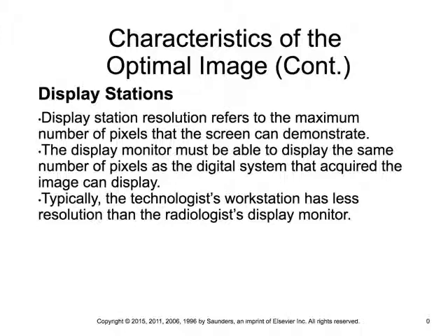So a lot of times what we do is we turn down the lights, we try to decrease the amount of light pollution or light noise in the area so that we can better visualize what we're looking at, right? But ideally they would just buy us nice monitors and nice ergonomic places to look at these pictures, so that we're not uncomfortable, sitting at some funny angle in a really noisy room while we're looking at our pictures.